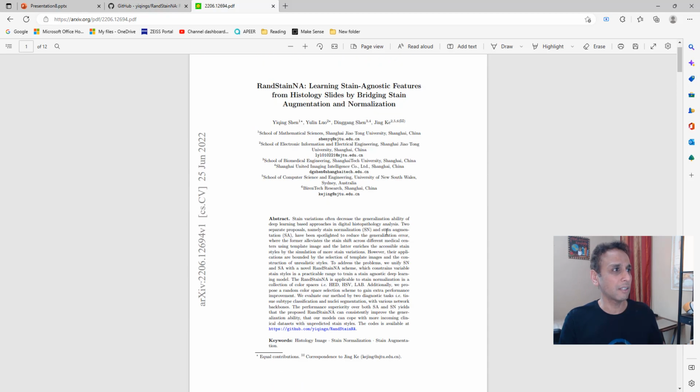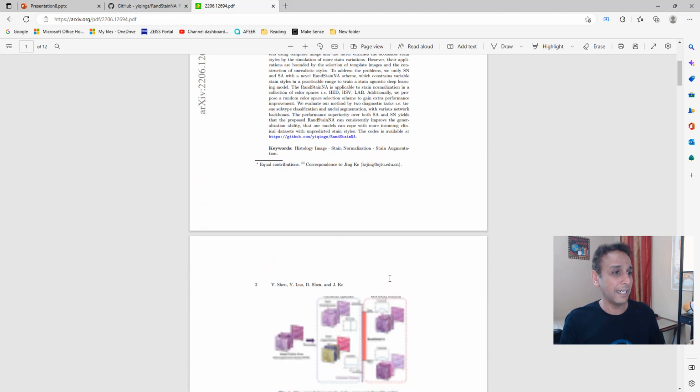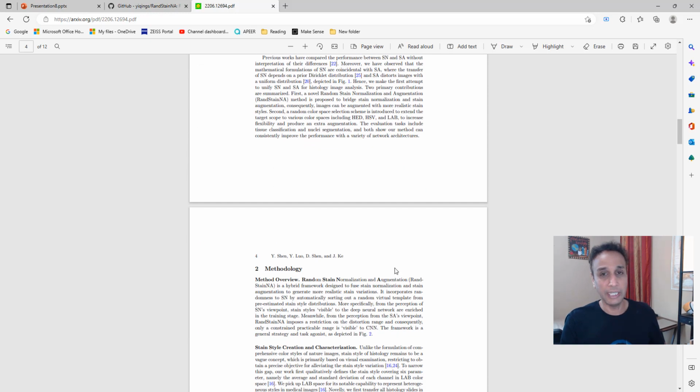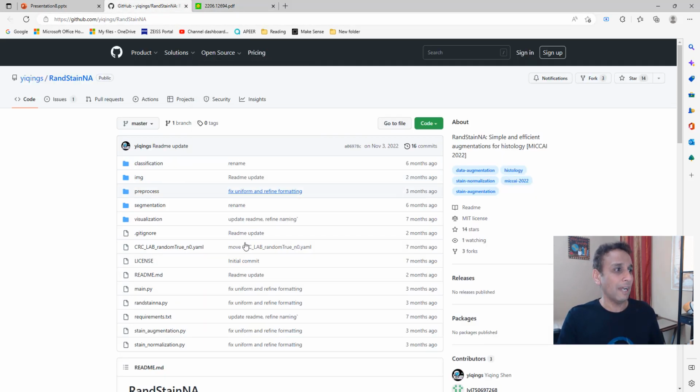You can go ahead. This is just from June 2022, a year ago, right? I mean, less than a year ago right there. And you can see that you can read the entire paper. Like I said, it comes down to a couple of steps, which I'm going to show you in a minute. And they also have the code.